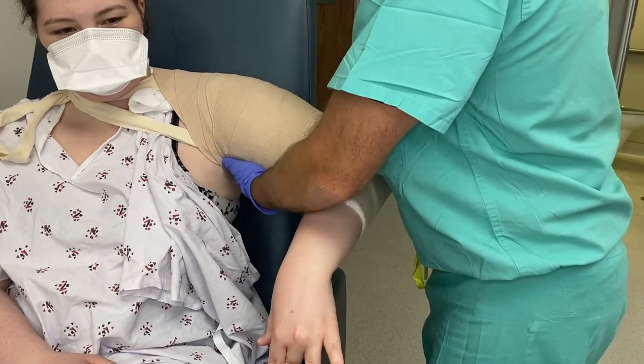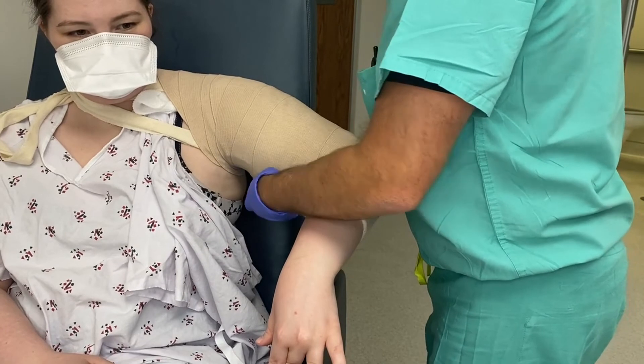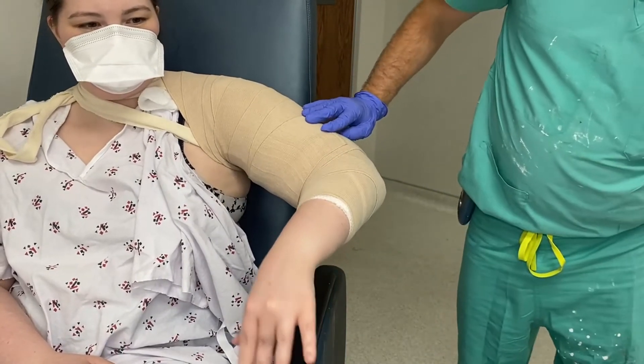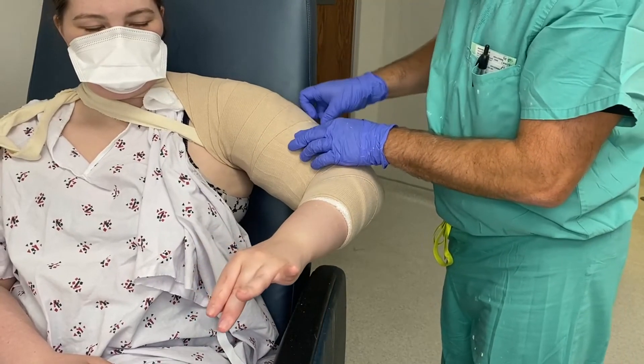As you can see, it looks like a shoulder pad. This splint works on gravity so you don't need to add a sling to it or anything. You can have the patient sitting up. You can also do this laying down, but it's easier to apply this if the patient is sitting up.